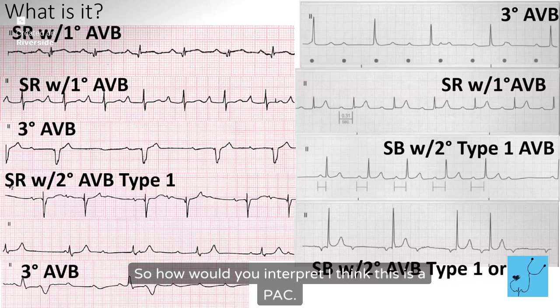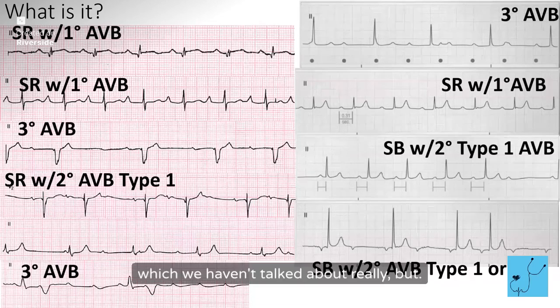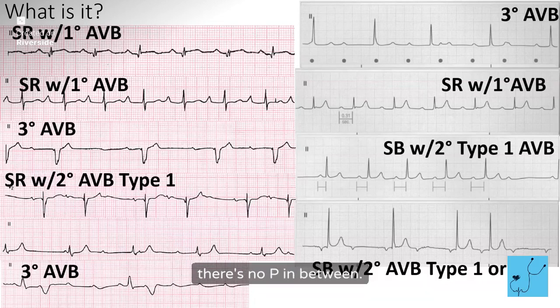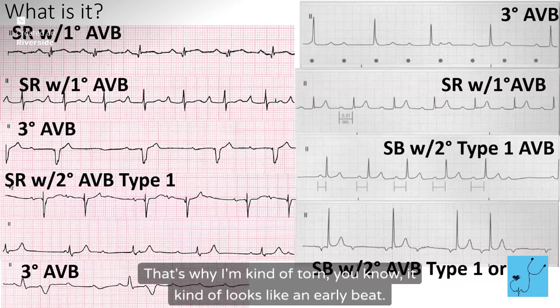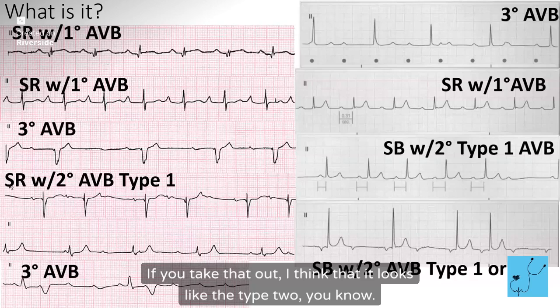So how would you interpret this rhythm? This is a PAC, which we haven't talked about really. But there's no P before it, like there's no P in between. Usually yes, and it looks exactly the same as the others. But see, this looks like it comes in a little early, and it's the same shape as the other impulses. That's why I'm kind of torn, it kind of looks like an early beat. But I think if you take that out, it looks like the type 2.